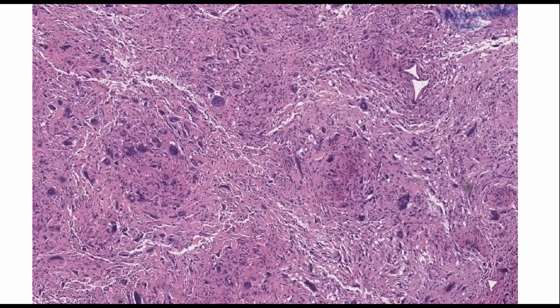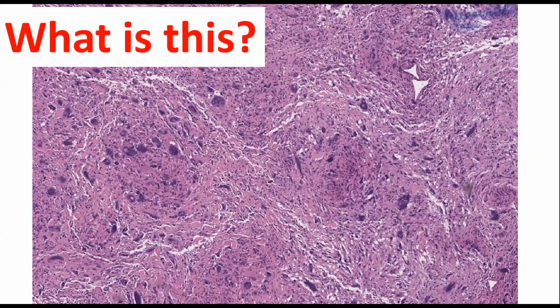And look, this is a little bit higher powered. Can you see it looks like kind of these dense islands and then valleys with a river or something in between? Now, I'll tell you, this is a giant cell glioblastoma. Great, high incidence of TP53 mutation. That's the associated. So that's not what we're talking about here. I knew the diagnosis. There's no question about that. It's this odd appearance, and I'm thinking, I haven't seen that before. What is it? All right, now here's the point where I'm going to ask everyone attending. The question is, actually, there it is. What is it? And the answer to what this odd appearance is on this slide. But it's small.